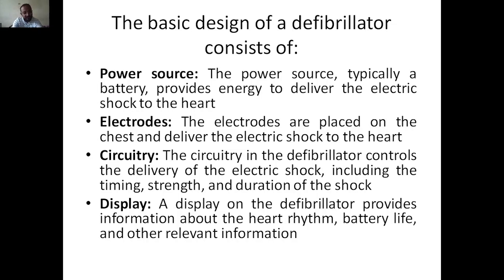Okay, next, display. So display should be there, where it provides the information about the heart rhythm, battery life, and other relevant information. So display will be given, so that after giving the shock, we can see whether there is any change in the electrical activity of the heart. So that display will have that information. Also the battery life of the defibrillator, because giving a shock requires a huge amount of power supply.